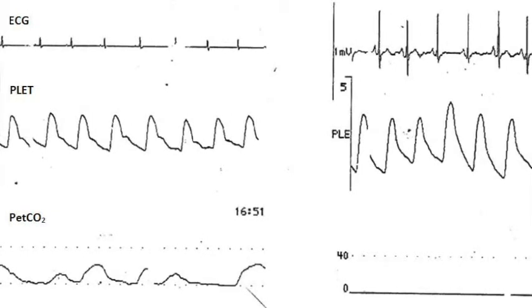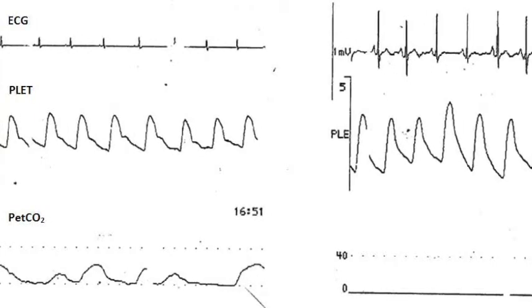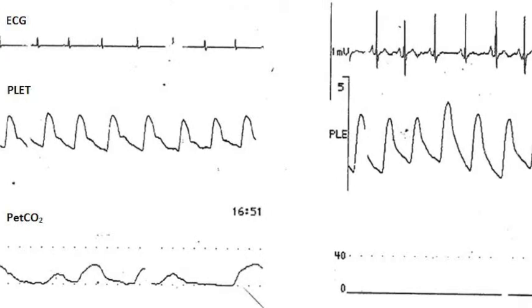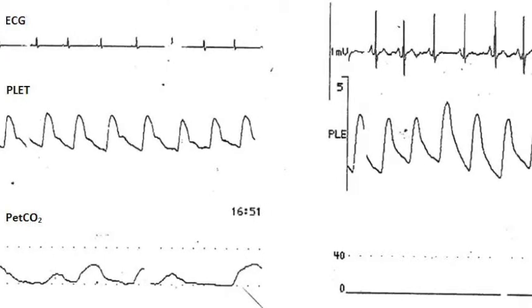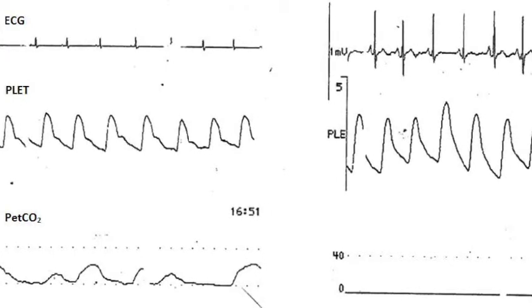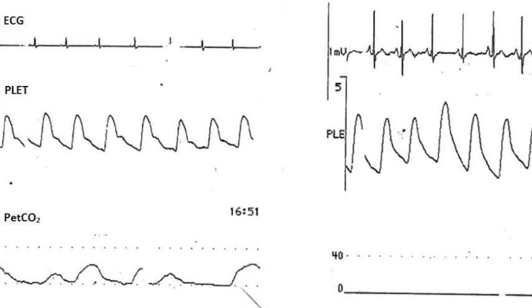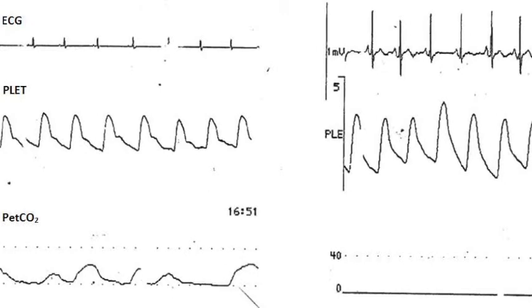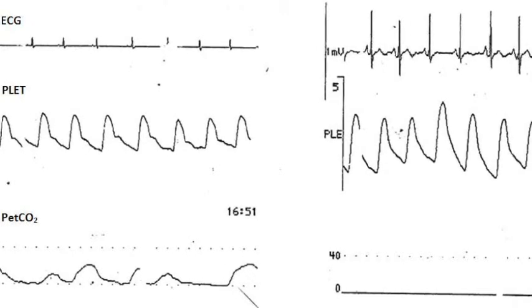If respiratory obstruction is possible, it is important to also examine the capnography waveform. For example, in one of the patients with upper airway obstruction with associated large variations in the plethysmographic waveform, the capnographic waveform disappeared. For 2 of the patients, the arterial pressure waveform also showed significant variation.